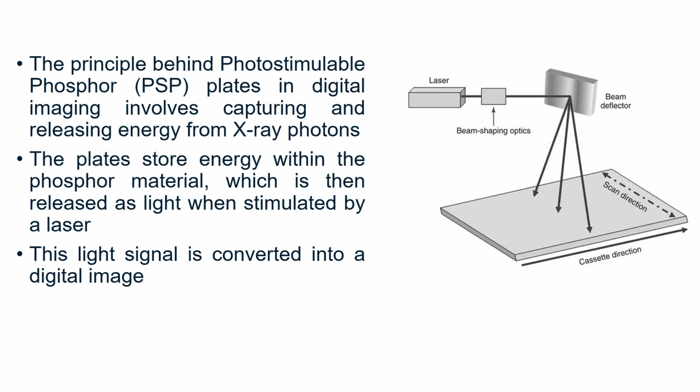Let us discuss the principle of computed radiography. The principle behind the photostimulable phosphor plate in digital imaging involves capturing and releasing energy from X-ray photons. The plate stores energy within the phosphor material, which is then released as light when stimulated by a laser.